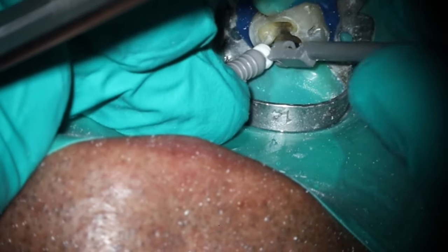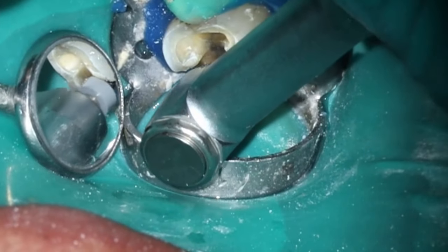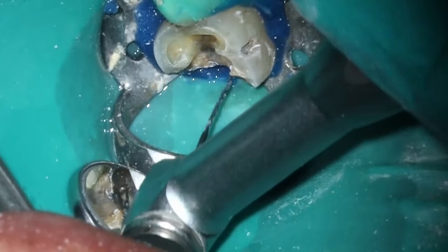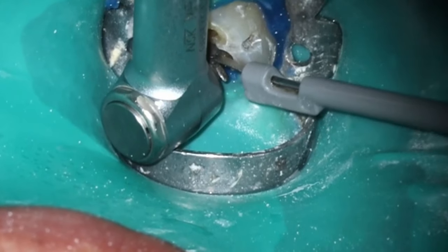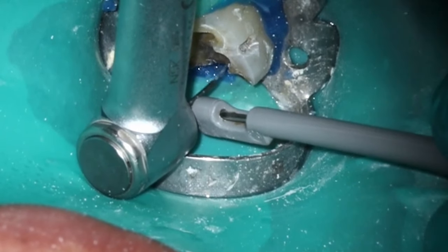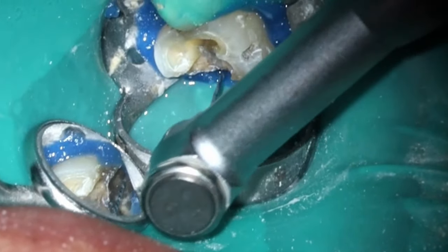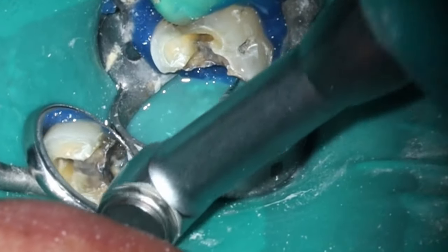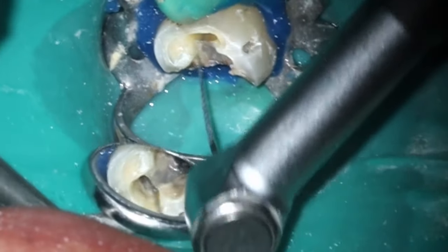There's a little calcification at the apex as well — had trouble getting down with the 10, and my 10 was bent like crazy. Ended up getting length with the 8. Taking these down now with the 17, getting everything cleaned out — pretty straightforward from here. I did want to double-check the length with the rotary. Sometimes you'll find you can't pull it back without spinning it, so that's what we're doing here. Had a little bit of leakage on this one as well, but eventually got a nice repeatable working length and got everything looking good.